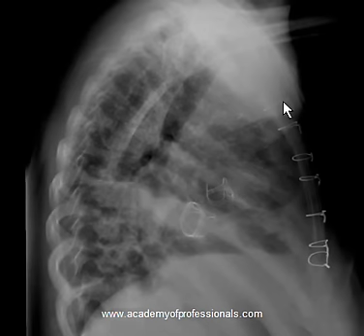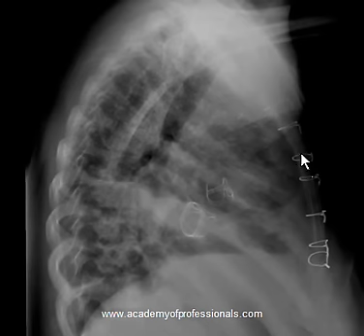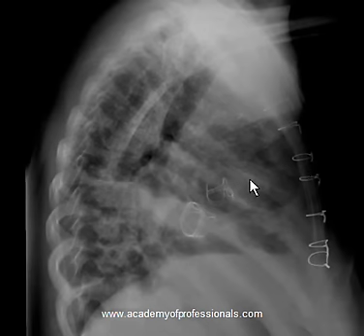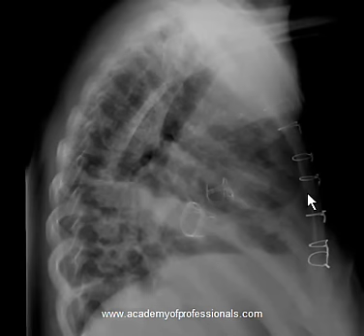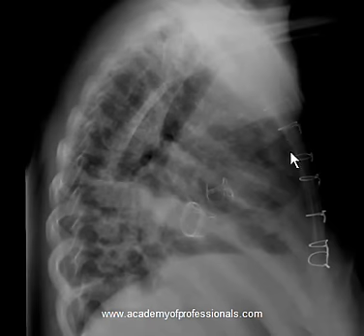The other thing to note is that on the lateral view you can clearly see that these wires are actually holding the sternum back together. On the AP view this was not obvious because the sternum is not clearly visible on an AP view, but on the lateral view you can certainly confirm that these wires are holding the sternum together.